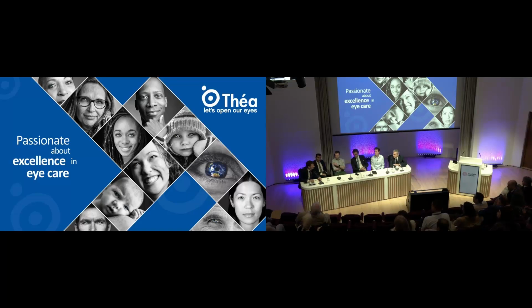Okay, I'll answer the first one and then I'll pass the second one on. The question was the effect of any form of corneal laser surgery on biometry. So yes, absolutely, you need to know. It's not the headache it was, even before my time. Even with contemporary formulae now, you can get very accurate biometry, so long as you know ideally what their treatment was, be it myopic or hyperopic. You don't need to know what type of corneal laser surgery they had. And yes, it's still less accurate than a virgin eye. But for most of us in the audience, by the time we get a cataract, you can assume the calculations will be even better. So that shouldn't be a rate-limiting step. But certainly patients need to know that they need to mention it and that it is an issue.